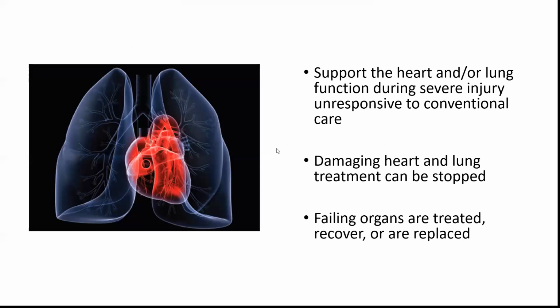It's for heart and lung support when your patient has severe injury, and the conventional methods that we use to care for this patient aren't there. When we have someone with heart failure, some of the modalities we put in, some of the devices, some of the inotropes, they actually can create damage, right? Those medications, in addition to vasopressors. When we have someone on high ventilatory settings, we know that that can create short-term and long-term damage for these patients.